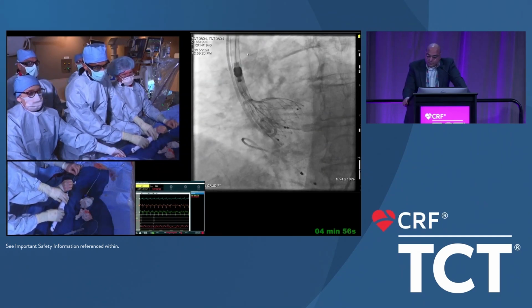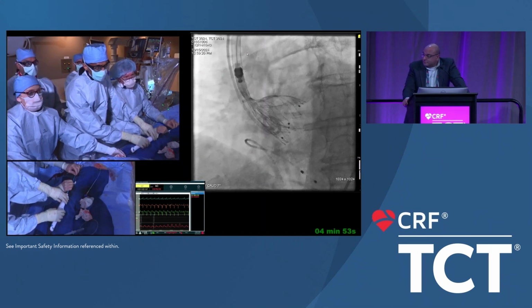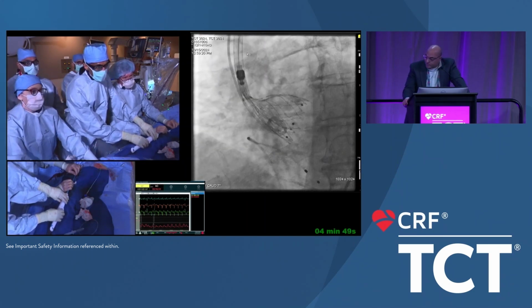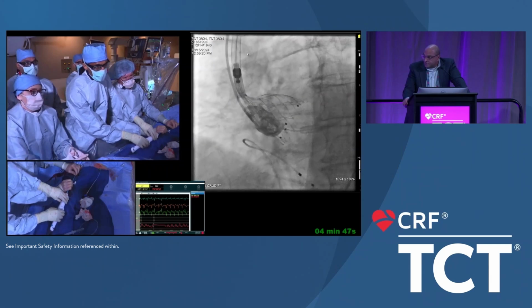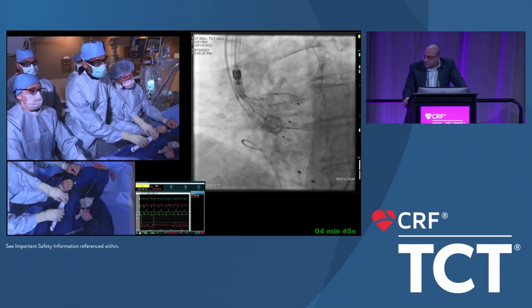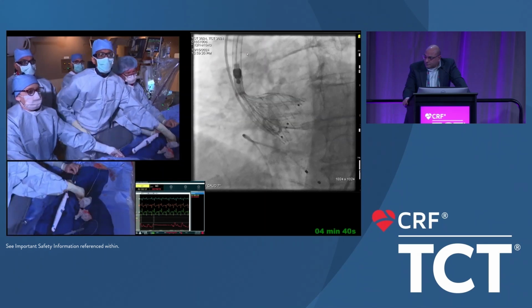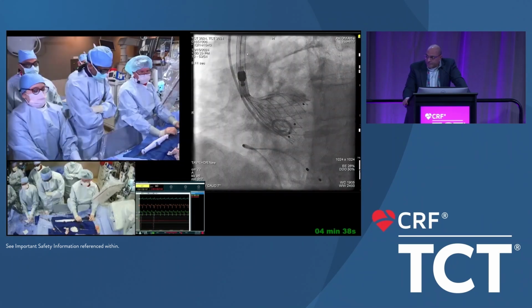So you would have recaptured too, Didier? Yeah, I would. I don't think you lose much. But I think that it could be deployed here for sure. But if you want to avoid any final movement or things like that, the more coaxial you are, the better it is before the final release of the outflow.